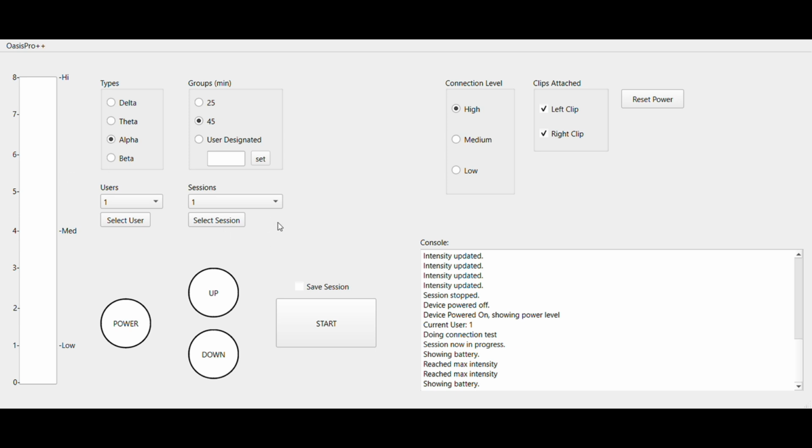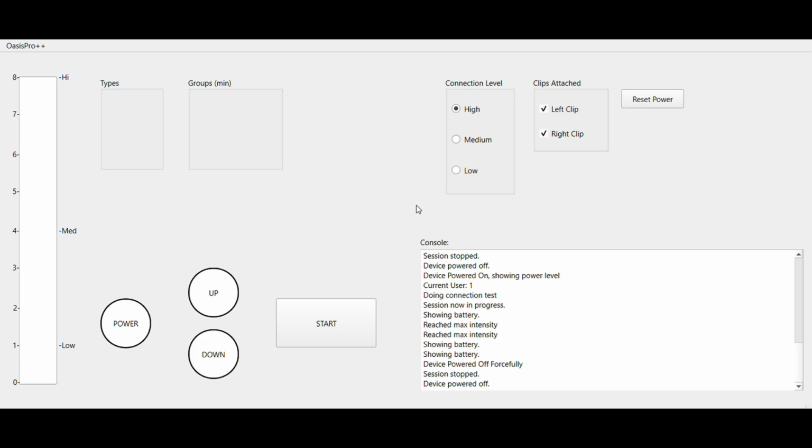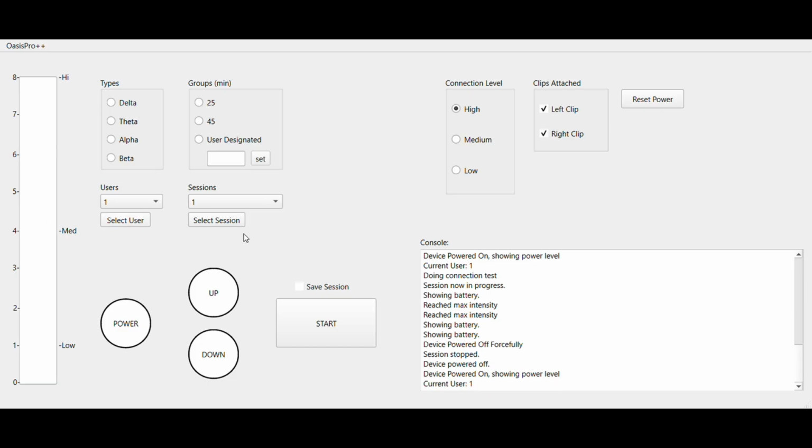Now I can go into a little bit more detail here, maybe with some specific events, like what would happen if you just powered off the device before the session ever ended. What happens? Well, as you can see, it tells you the device powered off forcefully, session stopped. If you turn it on, it will work as expected. The battery's still drained, everything still works, and you could select your user.